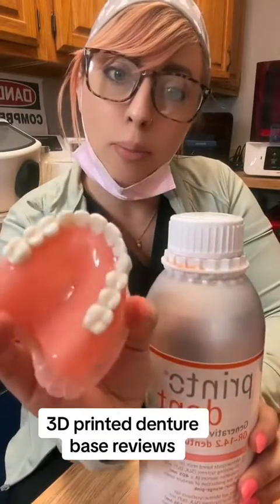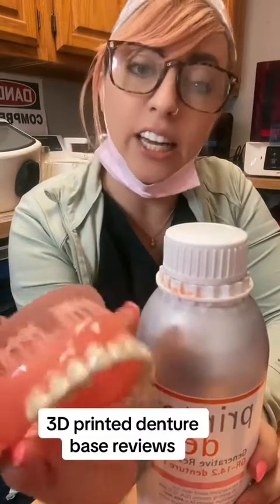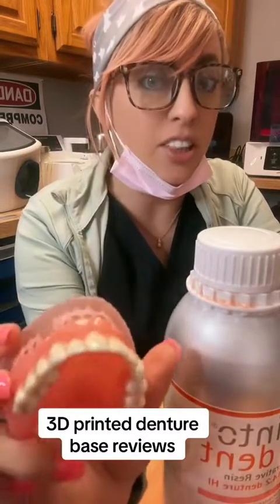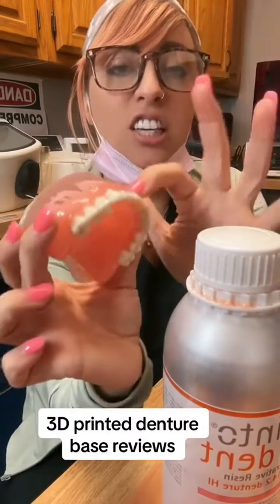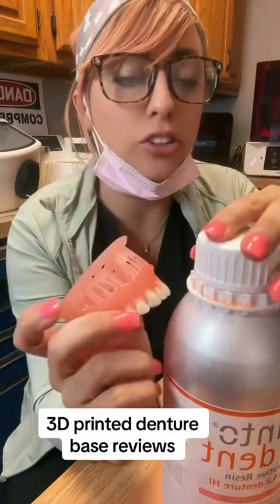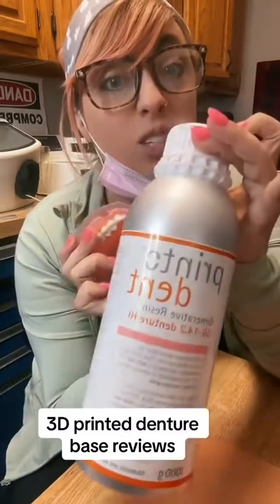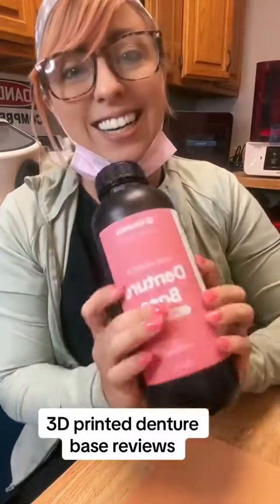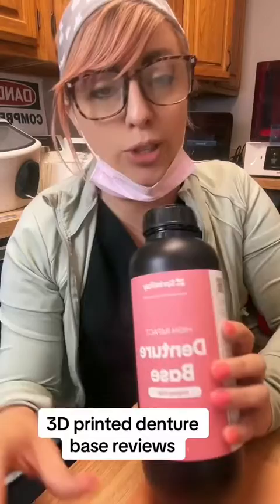Then we have Pro Thacher — love Pro Thacher. It's a little bit orangey, really easy to candy coat. I pair it with Onyx teeth, love it. Onyx breaks easier than the high-impact teeth though, so the teeth are actually more likely to break than the base itself, just because of the type of material. I really like this one and I've been using it for well over a year.